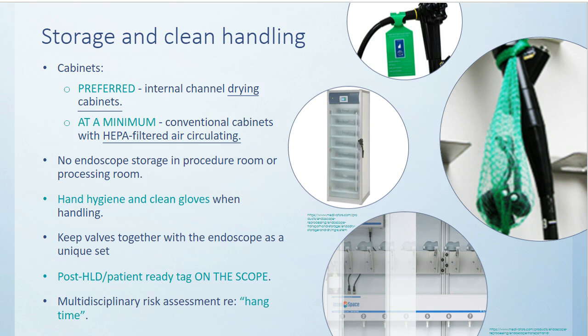Because if you think about it, if you're doing everything right per the IFUs, you're adding in these quality measures through adoption of the standard, you're doing that inspection and cleaning verification, you're putting it through an AER, you're doing all of the steps of drying externally and internally with the compressed air drying, you're handling with clean gloves in a cabinet that's remaining closed, then why would we only get 7 days as an example? So that's really up to your facility to walk through. You may be able to get longer storage, or if you have poor practices, you may not be able to get any length of storage on it.